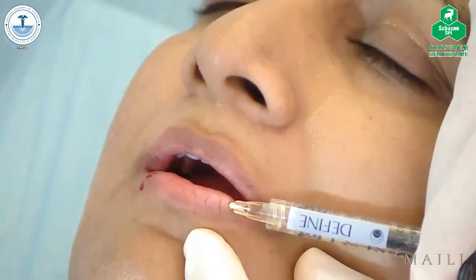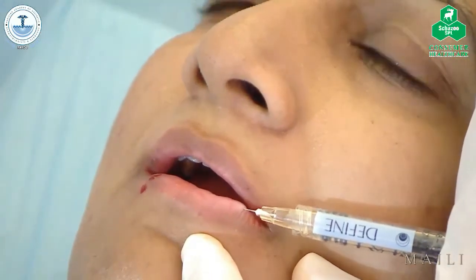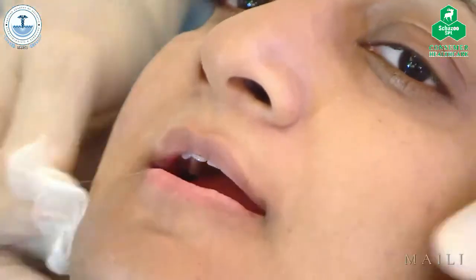Again, dry mucosa, junctions of both, and on the anterior part. Fine now, precise. Needle. It's very nice. Very nice.